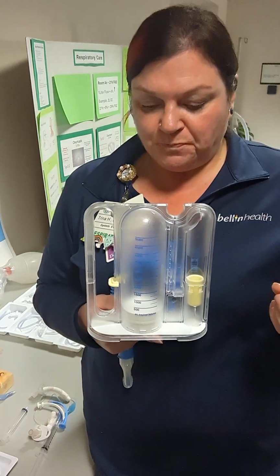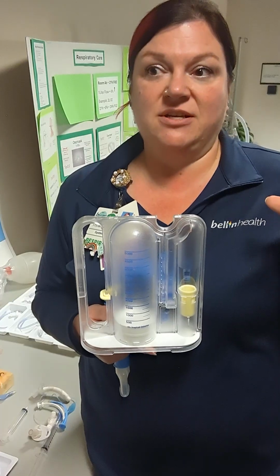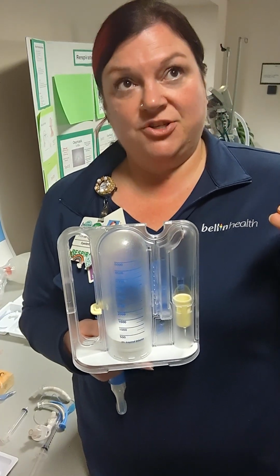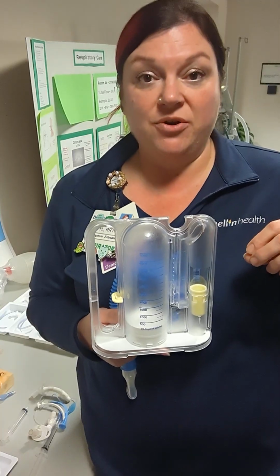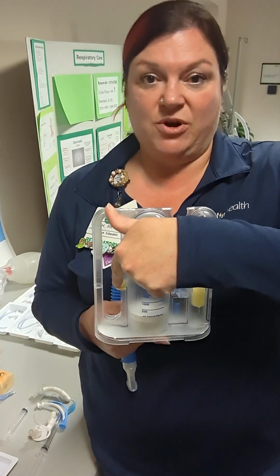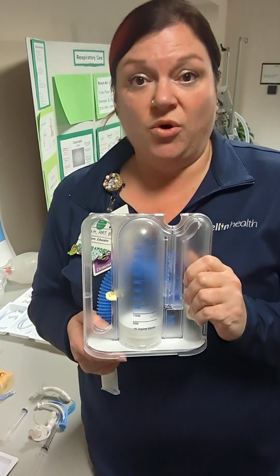Based on a patient's height, their age, and their gender at birth, we know what size breath to expect and where to put their little piece here, our goal.